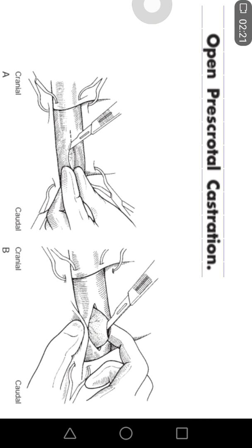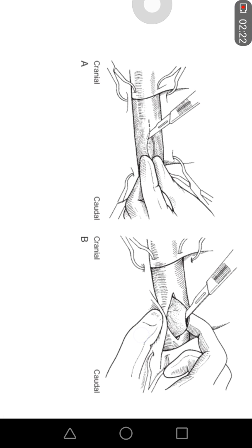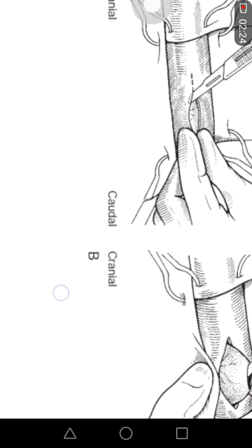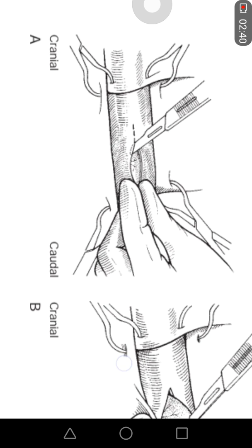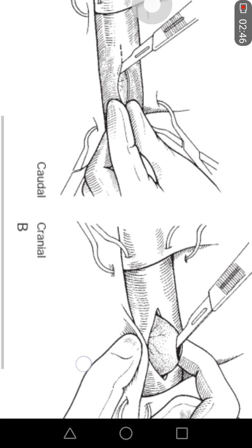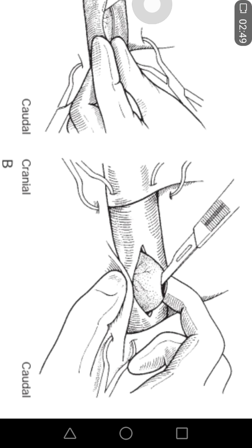To perform the open pre-scrotal castration, as you can see in this picture, after proper pre-surgical preparations, a small incision of two to three centimeters is given at the level of the scrotum. One testis is grabbed and approached toward the incision site. After the skin incision, an incision is given on the tunica vaginalis, which is then incised.